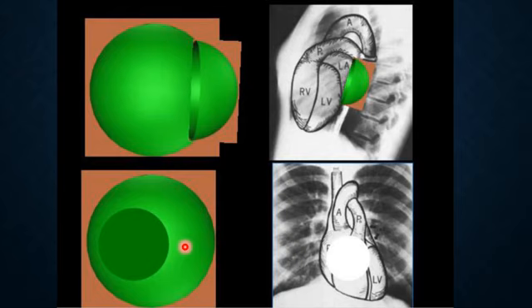What happens here is the following. In the lateral chest X-ray, let's imagine the lateral X-ray. This is the heart. Okay? The right ventricle is the most anterior one. The most anterior part of the heart is the right ventricle, while the most posterior part is the left atrium. And that's why we see it clearly during transesophageal echo. When they do transesophageal echo, the left atrium is in direct contact with the esophagus. Very close to it. Okay?